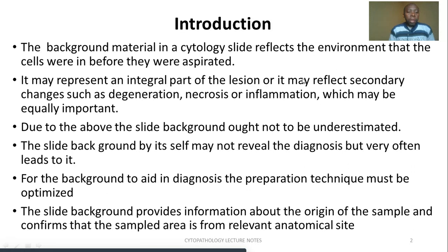We have other different issues and factors that we consider when making our conclusion, but background appearance is also very important. So the slide background by itself may not reveal a diagnosis, but very often it points us to a specific direction or a specific diagnosis. So it is very important to understand what it is.